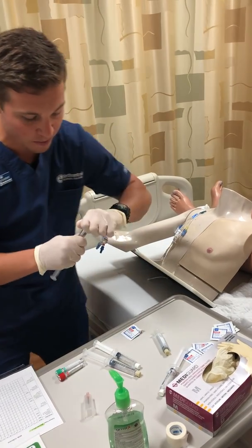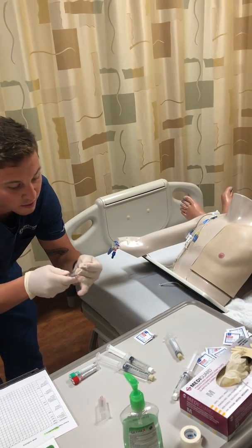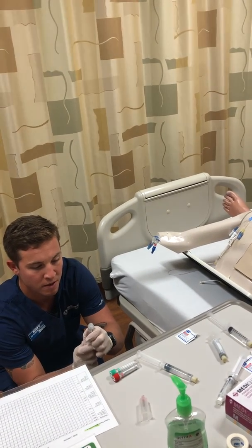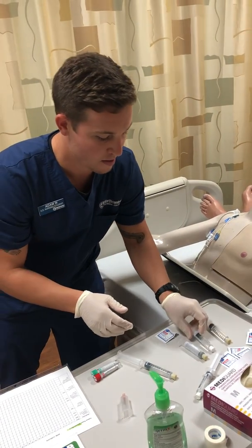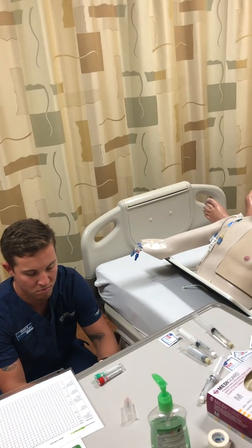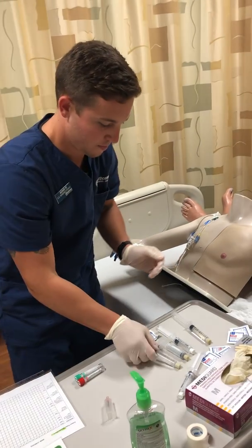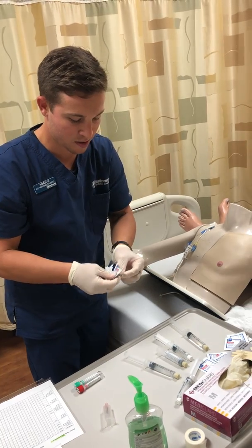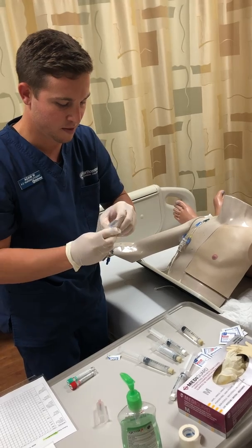We're going to make sure though that we have no air in here. We don't inject air into our patient. So this looks great. This one definitely has some air. There we go. Good. Okay. This looks empty. There we go.